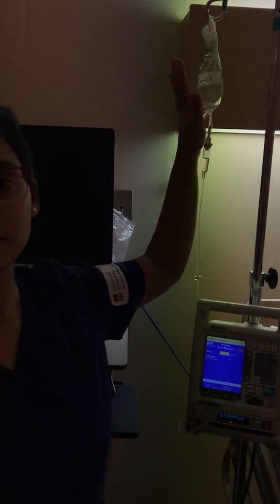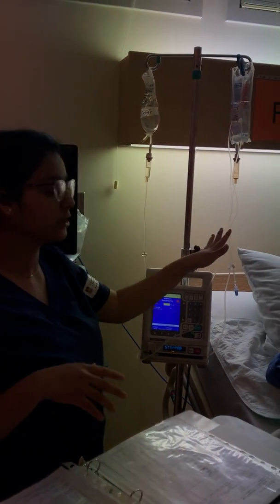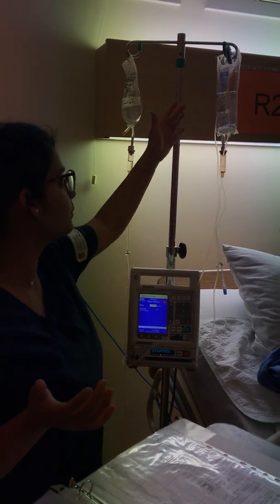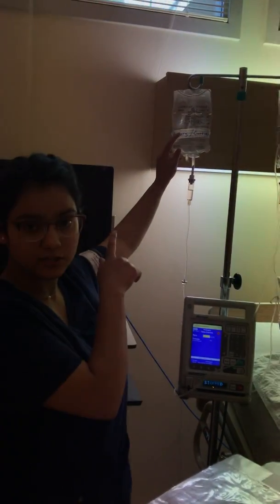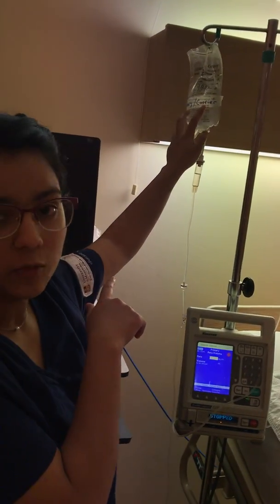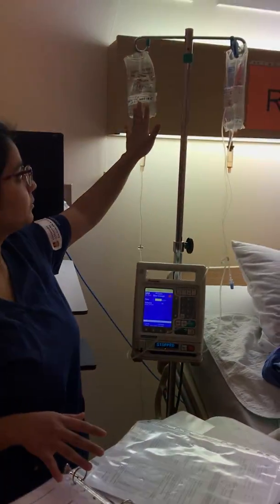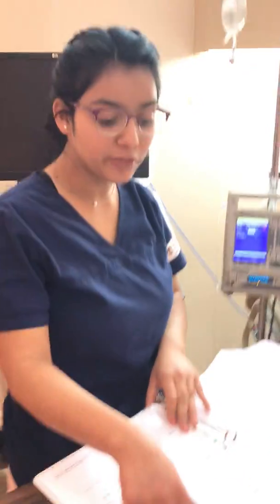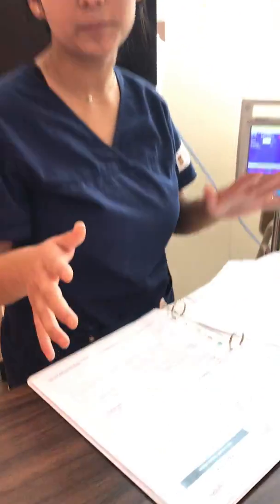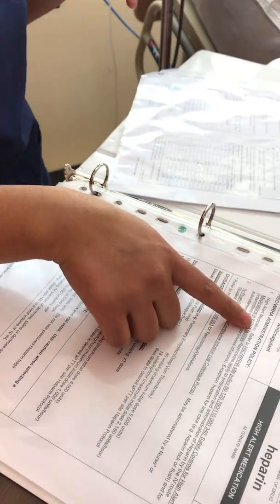I can see that my heparin is already made by the pharmacy. I can also see that my line is already primed by my buddy nurse. She already primed and hooked up the line. I can see the right carrier is infusing, which is the primary, normal saline, and it's compatible with my heparin because I checked the monograph. The monograph also says that it's a high alert medication, so I would need a second nurse, and that it can be given by a student nurse, so I can give this as a student nurse.